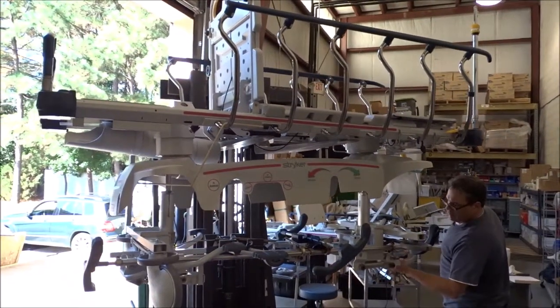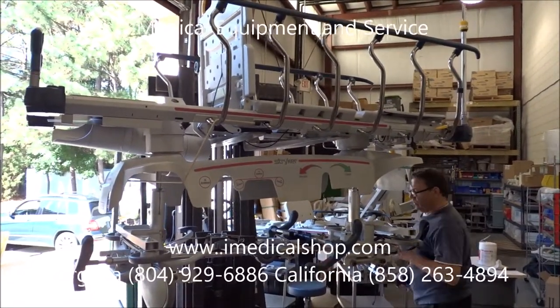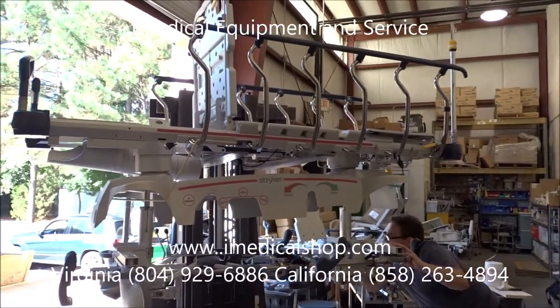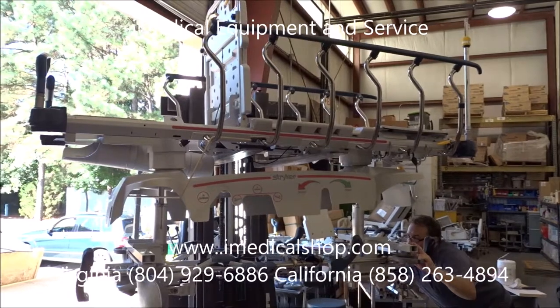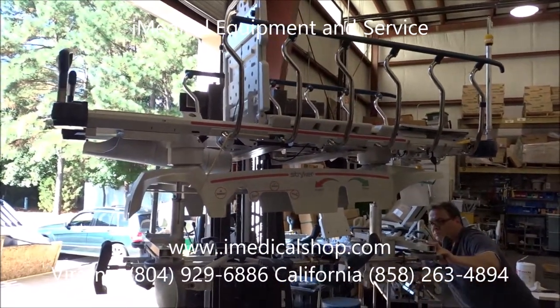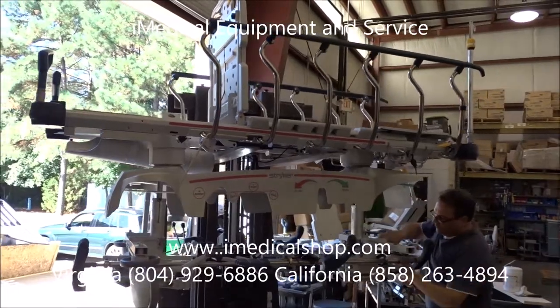We're at the iMedical Equipment Warehouse looking at the Stryker 1005 stretchers, and we go through a complete refurbishing process on these. I wanted to do a quick video to give people an idea of what we mean when we say refurbished.